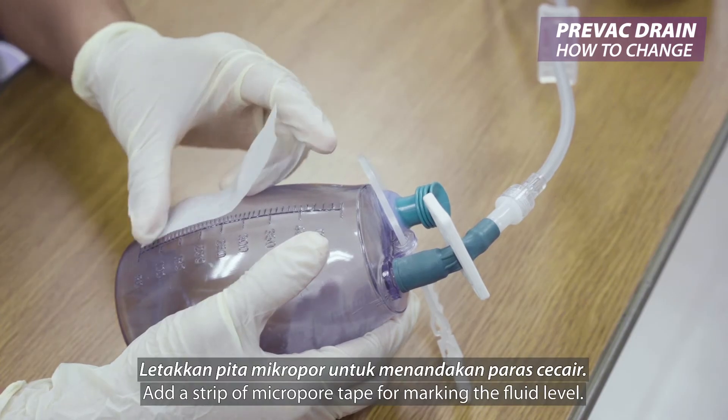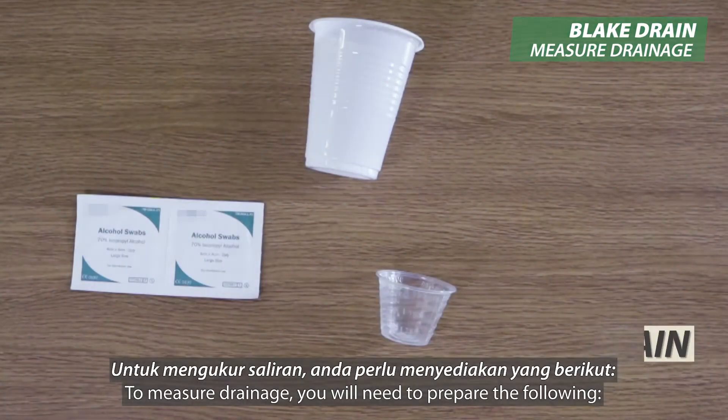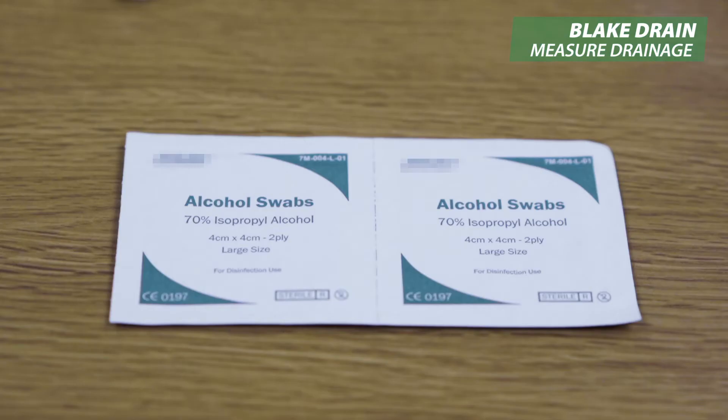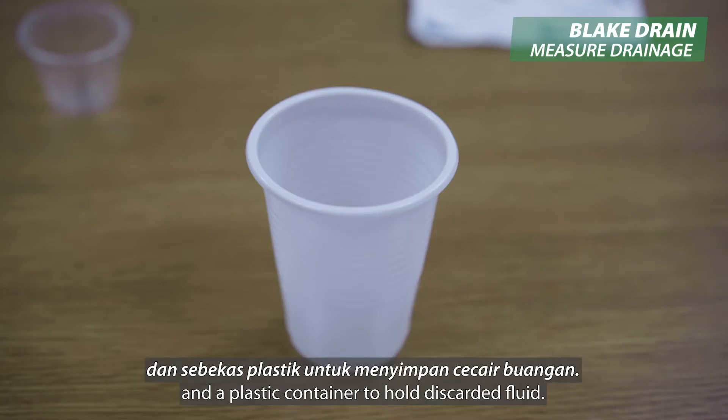Add a strip of micropore tape for marking the fluid level. To measure drainage, you will need to prepare the following: alcohol swabs, a 30ml measuring cup, and a plastic container to hold discarded fluid.